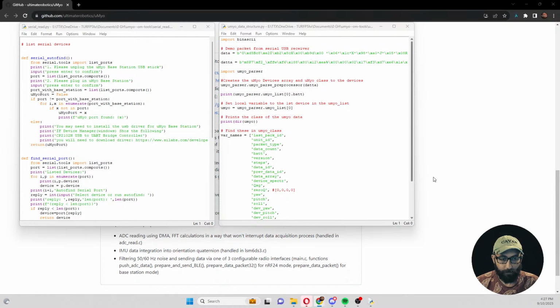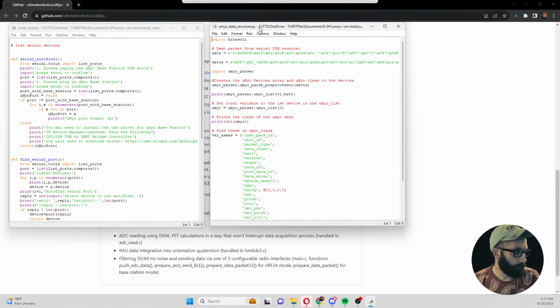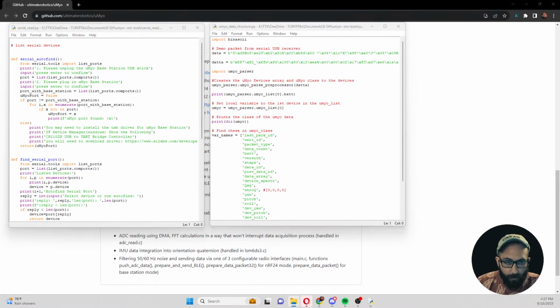And I might just have 2 separate Python programs to do that. It is probably not the best way. I should use multi-threading. But multi-threading is a little bit cumbersome, so it's just going to be easier if I just start a new Python instance. Hopefully that will work, but we are going to need to sync the time. So let's see how I can do that. So I'm going to open up the code that I have for Open Muscle for the LASK system. And I think I didn't copy it over. Okay. I will copy it over to the uMyo folder.